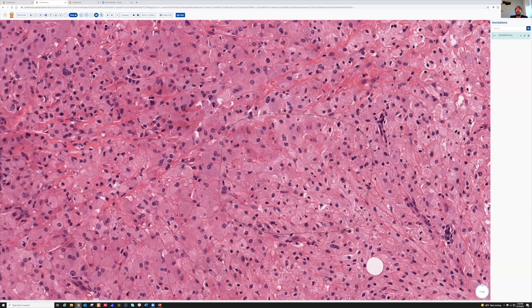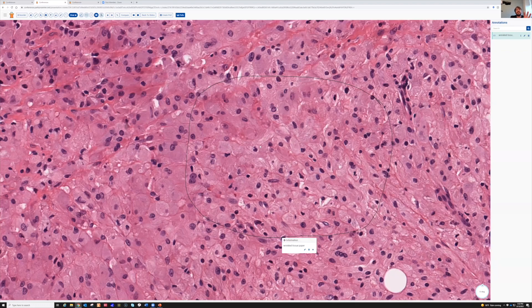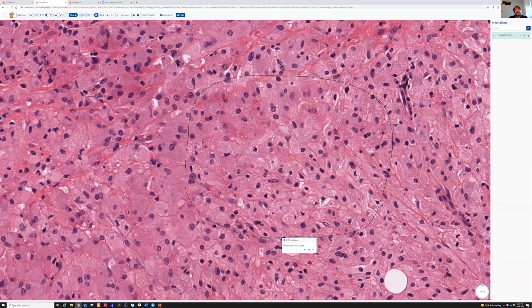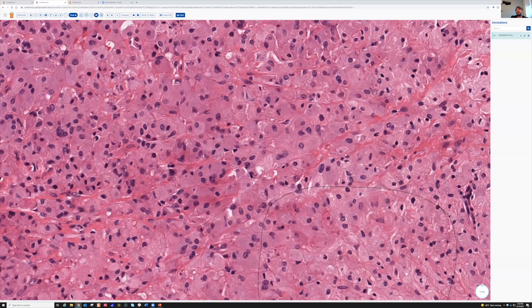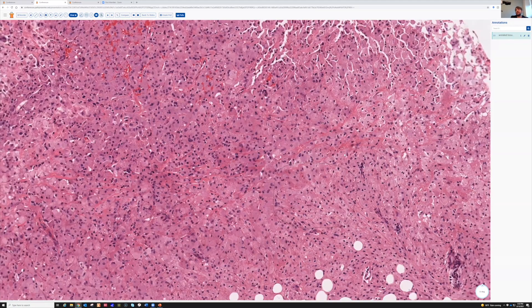I always remembered that the pictures I had seen of these cells with the wrinkled tissue paper were blue. That's because a lot of the time the pictures you see are from a bone marrow biopsy when you're looking at a Wright-Giemsa stain, which stains the cells blue. This is what it looks like on H&E — hematoxylin and eosin. A pretty great example of a very unfortunate and problematic disease.